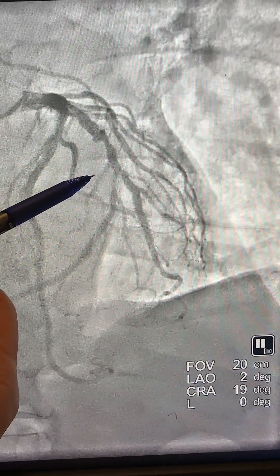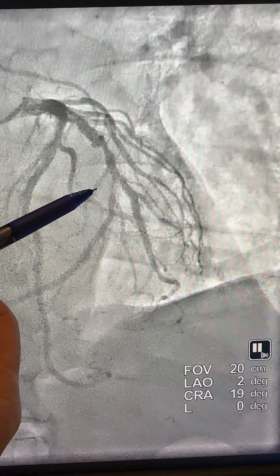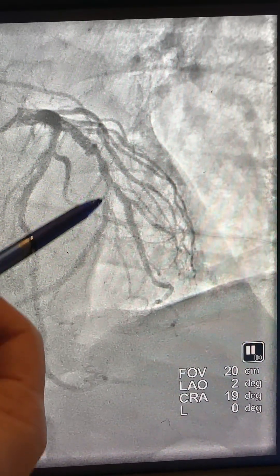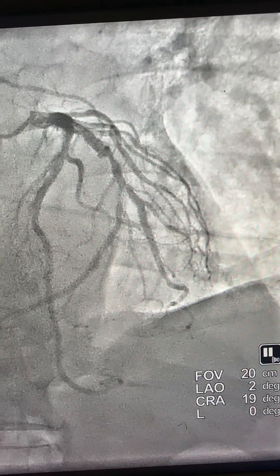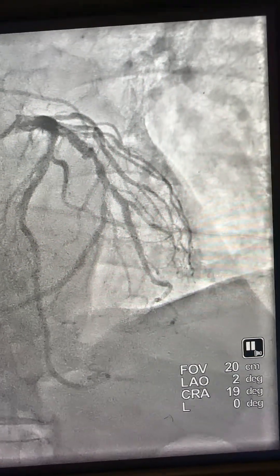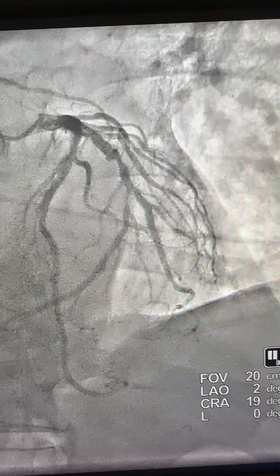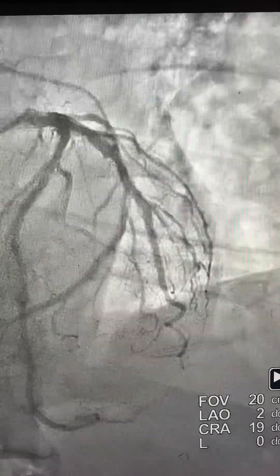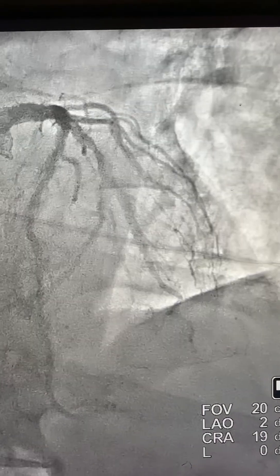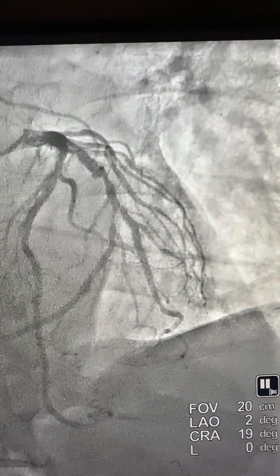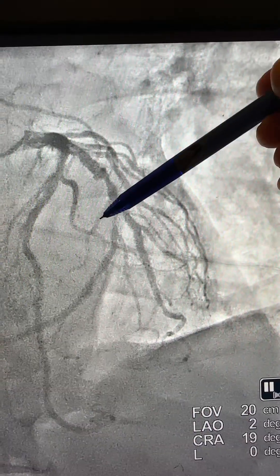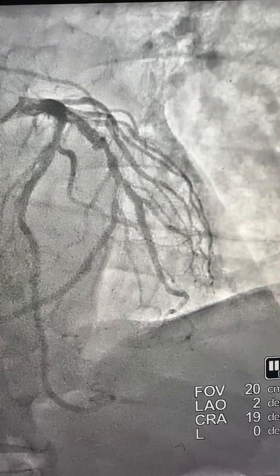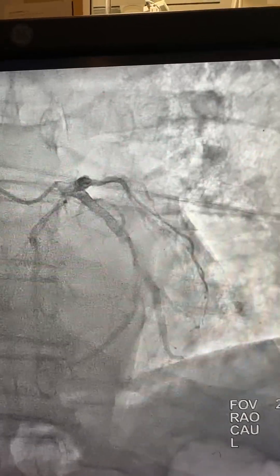Good evening. We have this case of bifurcation of the circumflex toward the OM major, OM, and then the left PDA. The circumflex is the dominant vessel. We have a stent here and a stent there. You can see the ostial OM before the stents is involved, and then the proximal — what we'll call the left PDA — is also involved before the stent. Here is another view.